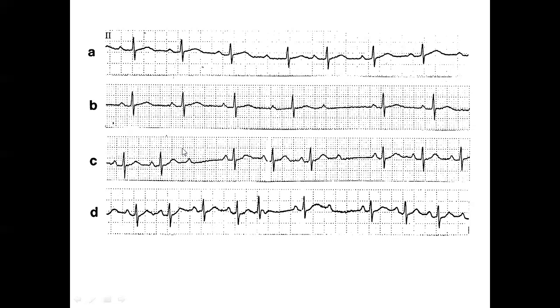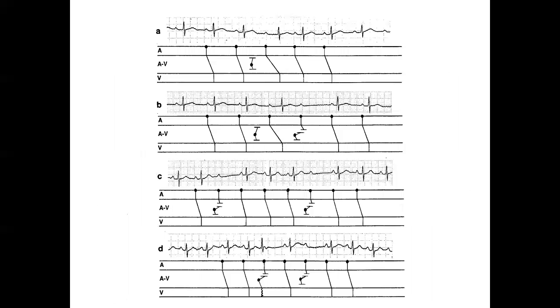I mentioned that in a given patient, in a given setting, they don't have type 1 and type 2 at the same time. So what's happening? First degree, unexpectedly, then type 1 and type 2, something is fishy. So what's happening is revealed by this one, junctional premature beat. We know that junctional premature beat can play all kinds of tricks. So there was a junctional premature beat.